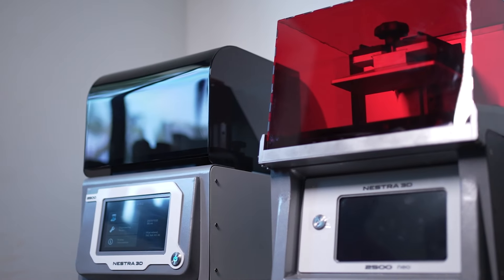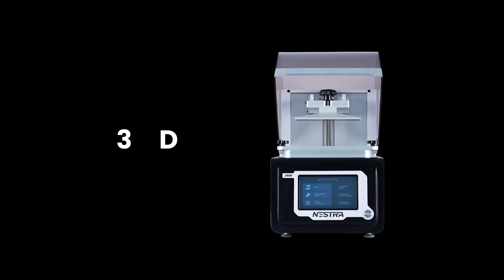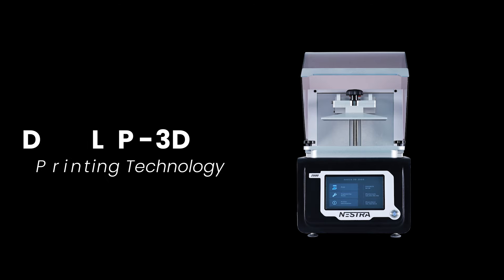Imagine printing your crowns chair-side at incredible speed, thanks to our state-of-the-art DLP 3D printing technology.